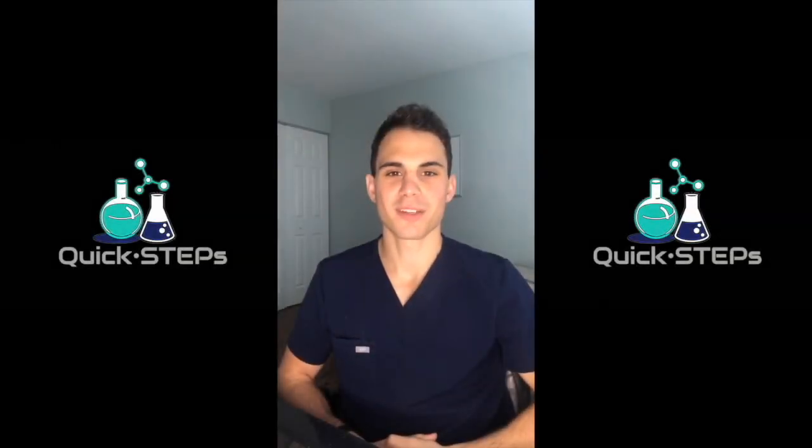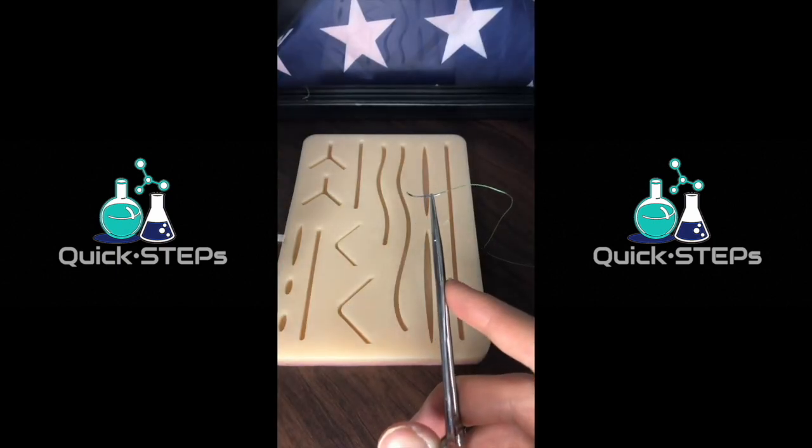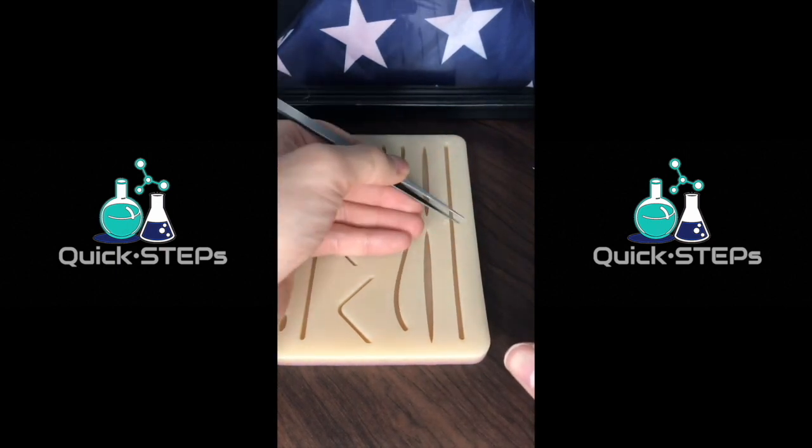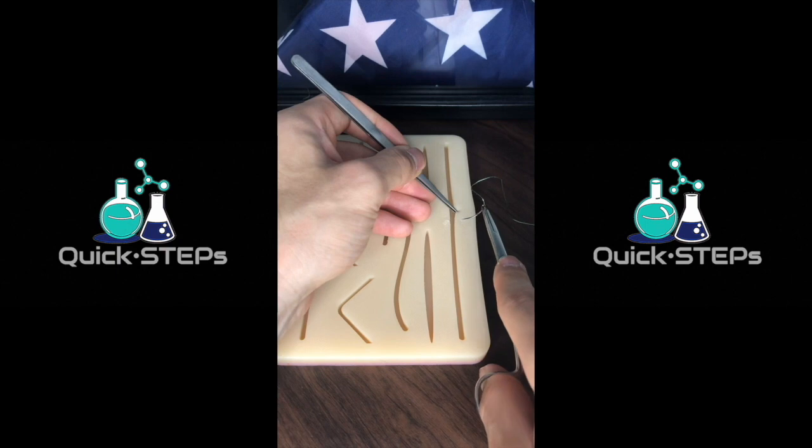Hey everyone, Ryan from Quick Steps here. Today I'm going to show you how to do the simple interrupted suture in under a minute. We start with the needle loaded about two-thirds the way back from the needle tip. You divide the wound in half and that's where you start. After that you just keep dividing in half until the wound is well approximated.